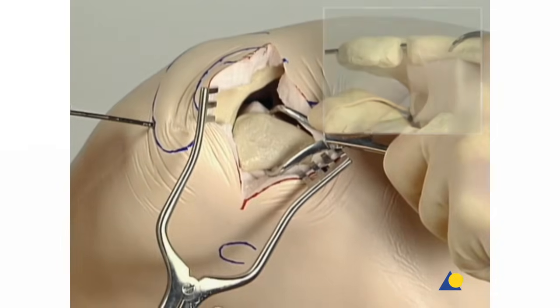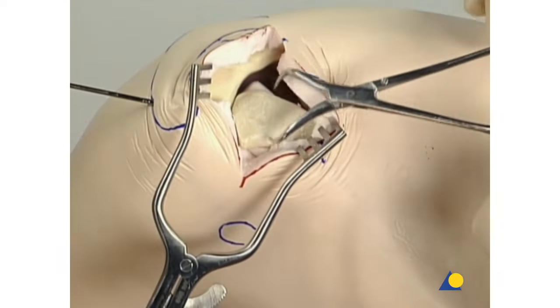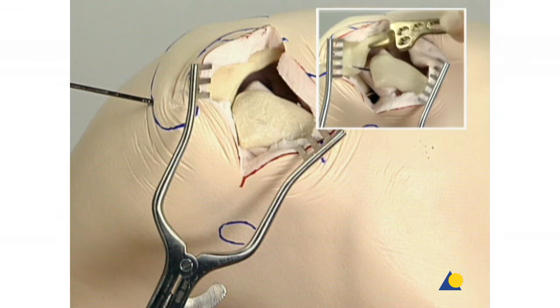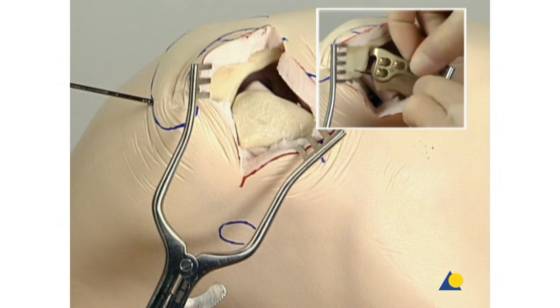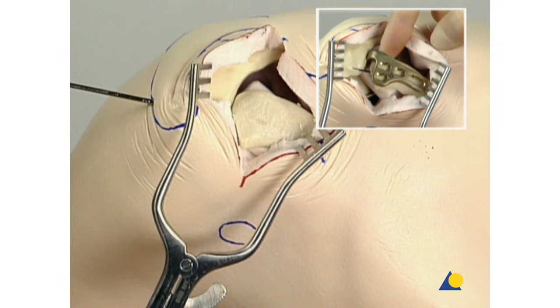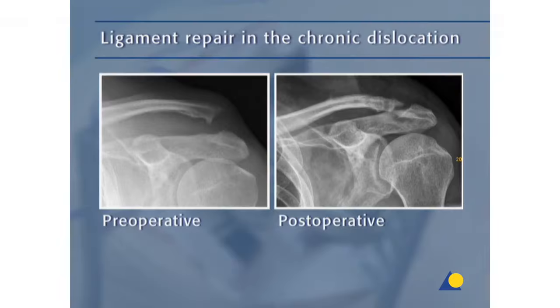Care must be taken that the clavicle be reduced in the correct horizontal position. This reduction can be confirmed with an intraoperative axial C-arm view. The posterior aspect of the AC joint capsule is identified and a 5 mm detachment of the extra-capsular fibers of the trapezius from the medial border of the acromion is performed. This detachment will allow the hook of the plate to pass under the acromion. In the fresh dislocation, the superior acromioclavicular ligament should be repaired. The coracoclavicular ligament can also be repaired. In the chronic dislocation, the ligaments in general cannot be repaired, so they have to be reconstructed.